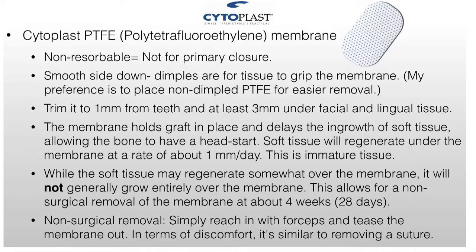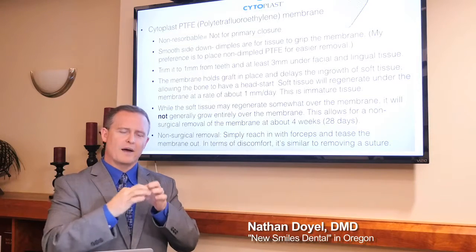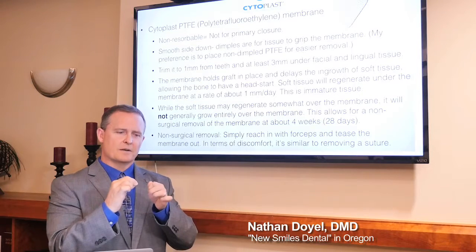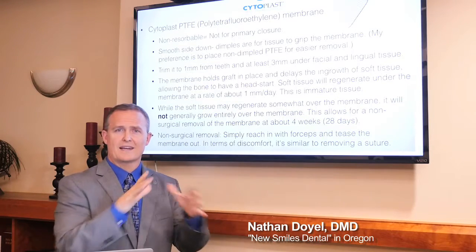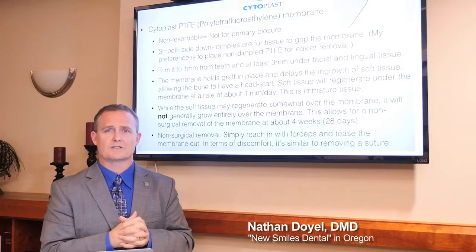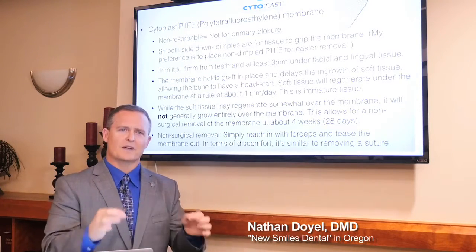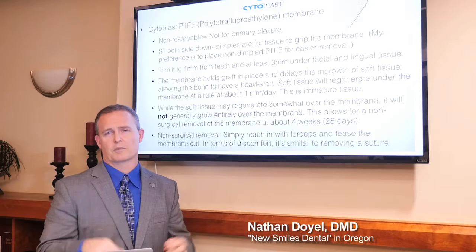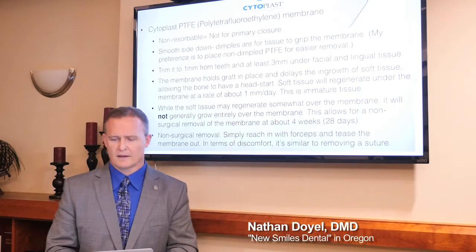But remove the sutures. I like the PTFE sutures as well. If you notice when I did the suturing, I do a single throw followed by a single throw, and that allows me to pull that down and lets the knot tie down and snug up in place, versus doing a double throw off the bat and then doing a throw. Oftentimes a double throw at the beginning won't allow you to sneak that knot further down and tighten up that membrane, tighten up that periosteum. So I do a single throw followed by a single throw, cinch it up, not too tight, but just enough to cinch everything together, and then do a double throw that locks it down in place. If you want to watch it again, you'll see how I did that.